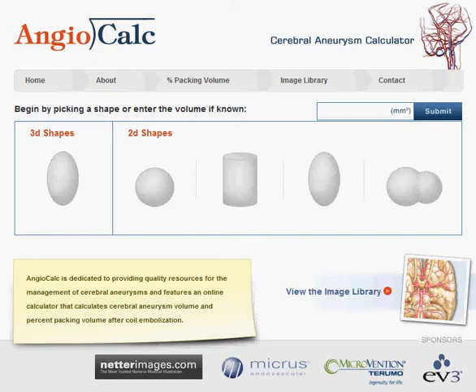Welcome to angiocalc.com. I'd like to take you through some of the basic features of the website.